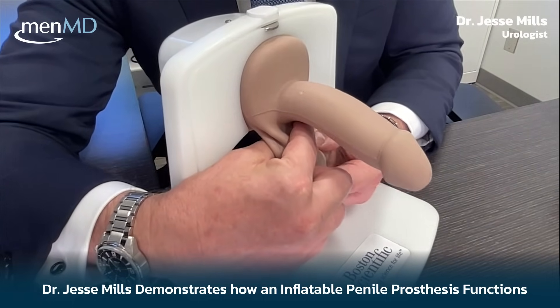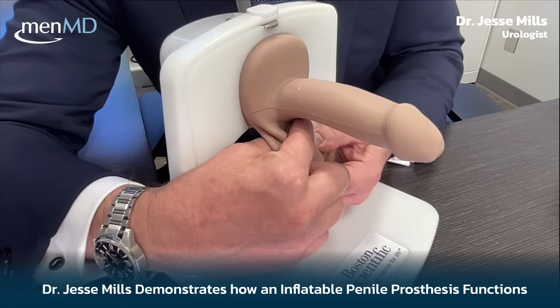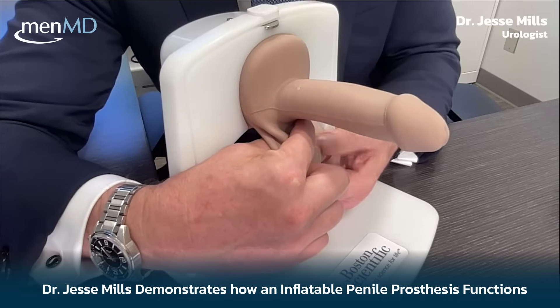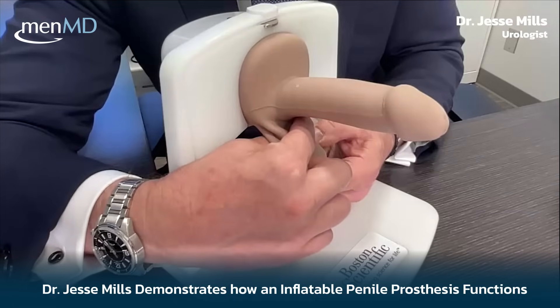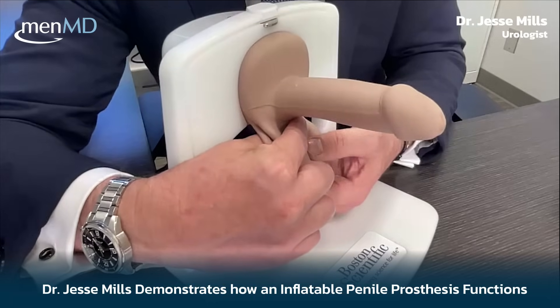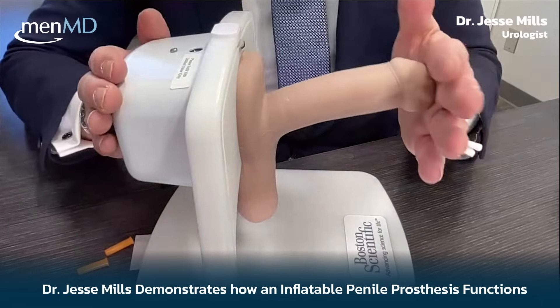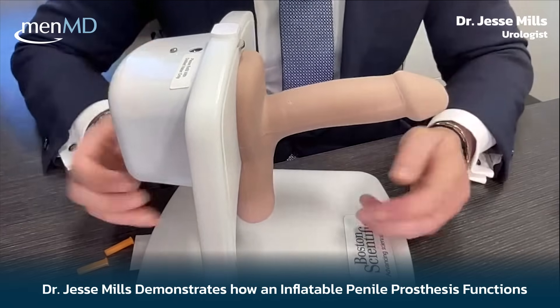Everybody asks, 'Doc, how many pumps does it take?' It really just depends on the cylinder size we put in — we always try to maximize cylinder size to fit the patient's individual anatomy. Some men it can take a few pumps, some a little bit longer. Once it's pretty maximally inflated you'll feel resistance, so I'm pushing pretty hard to get those last few pumps in. Now we have an implant that's fully erect.